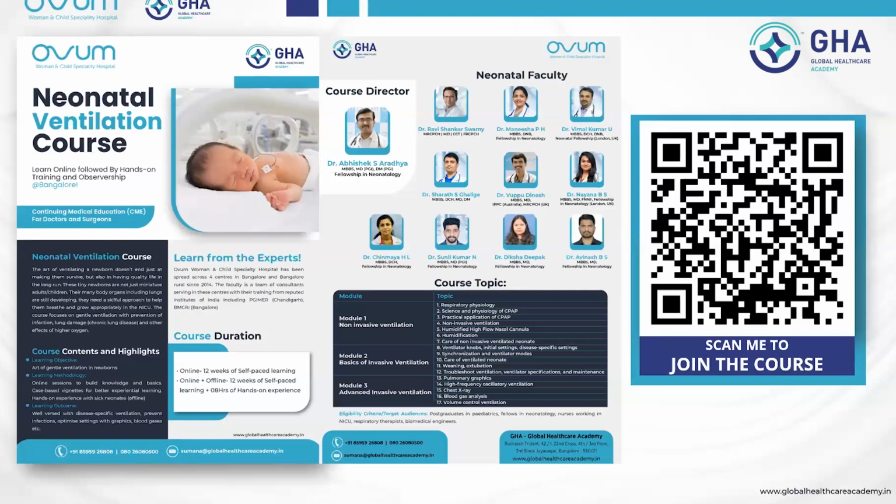I'll take one last question. What is the ideal height of the bubble chamber above the ground? Just keep it above the ground, but below the level of the baby.